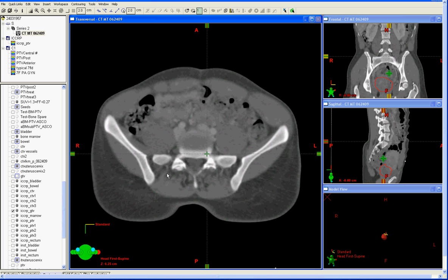Oral contrast was not. That's optional for this protocol. In this case, the patient had fiducials implanted in the cervical mass. That's optional. And vaginal marker or cervical marker is also optional to assist with target delineation. Those were not used in this patient.